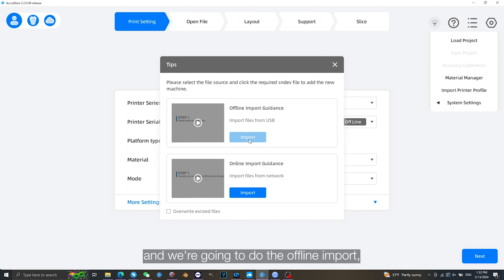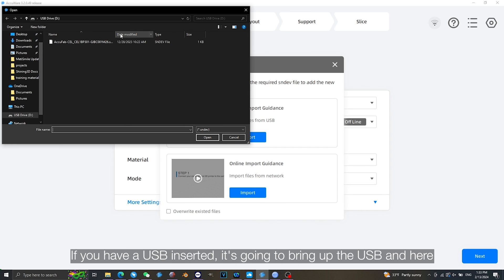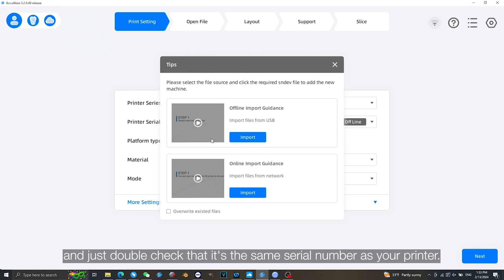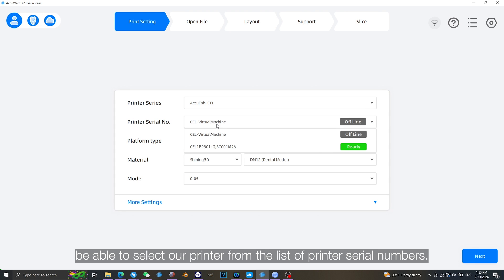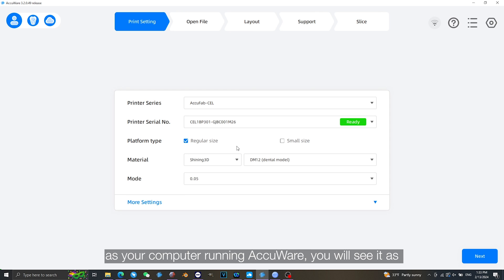We are going to do the offline import, which is the first option. It is going to bring up a menu, and if you have a USB inserted it is going to show the USB. Here you will find an SNDEV file which is the printer's profile. Just double check that it is the same serial number as your printer. We will open that, and we will now be able to select our printer from the list of printer serial numbers. If your printer is connected to the same Wi-Fi network as your computer running Accuware, you will see it as online or ready.